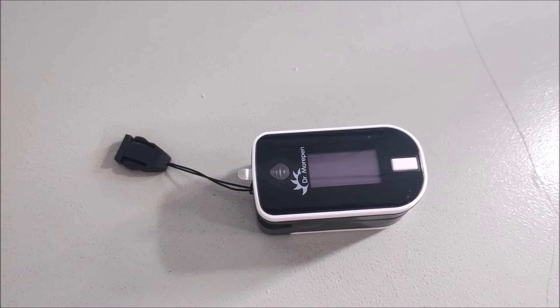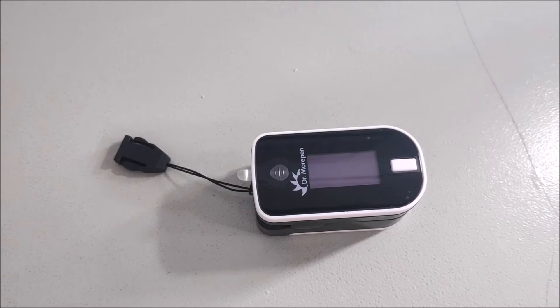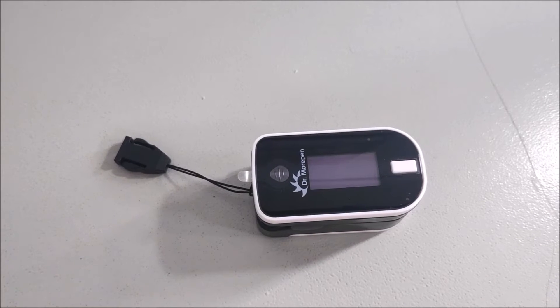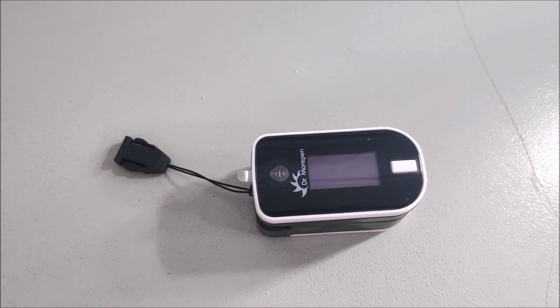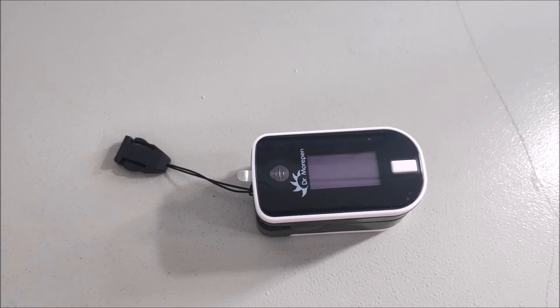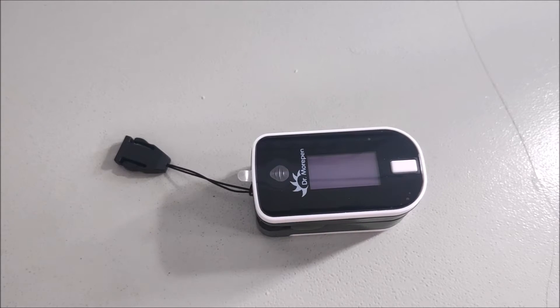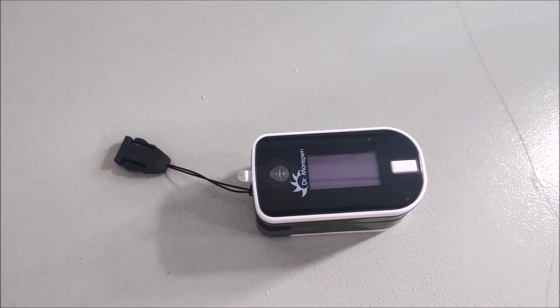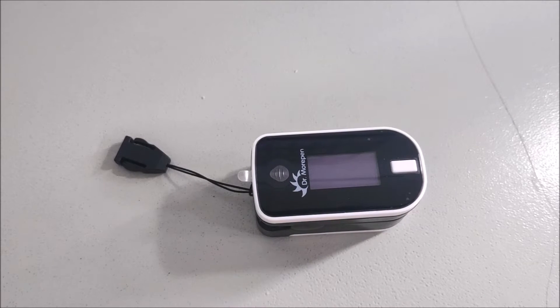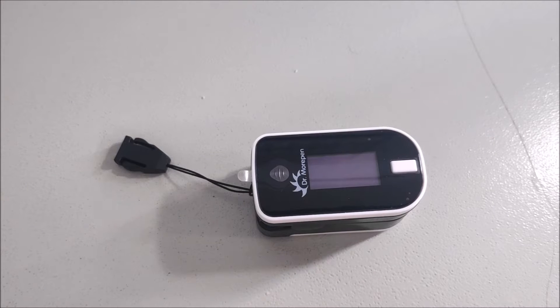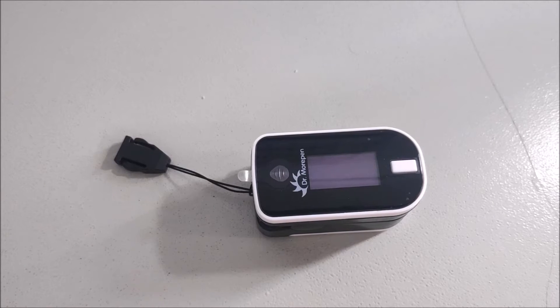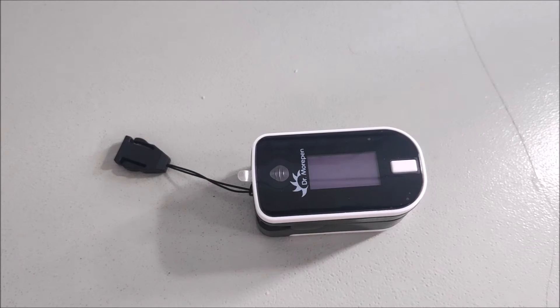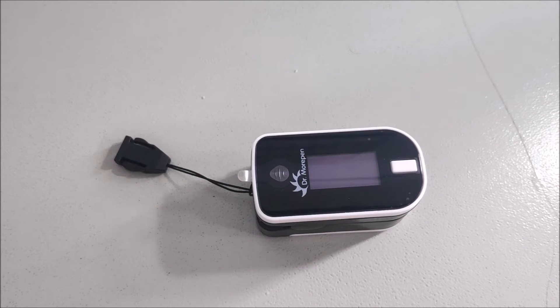Hello to everyone. Today we are going to discuss some important things about the pulse oximeter. As we are living in a pandemic of COVID-19, the pulse oximeter is a very useful instrument to measure our health status and oxygen saturation. In this video, we are going to discuss what information we can get from a pulse oximeter.